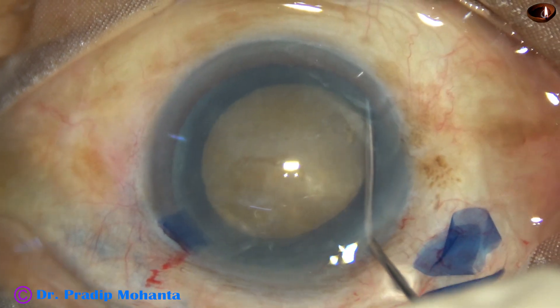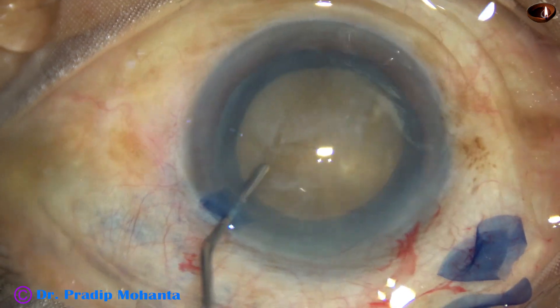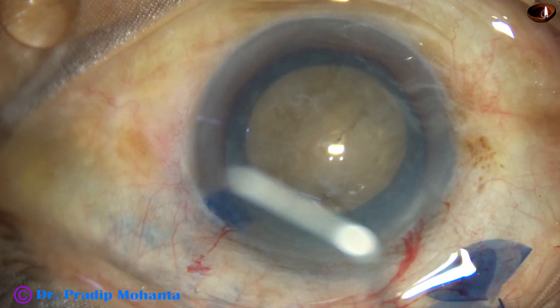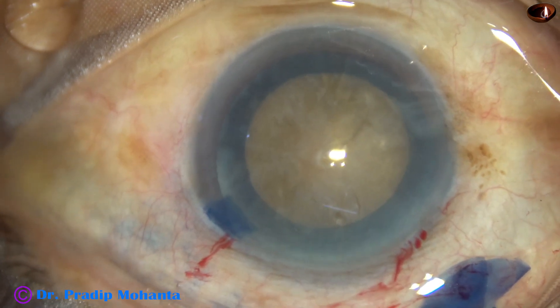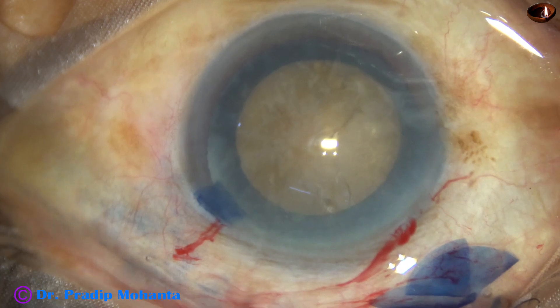In hard cataracts, if we want to avoid zonular stress and manage large hard nuclear fragments easily, we must do a large rhexis — not less than 5.5 millimeters. Hydrodissection is then performed.